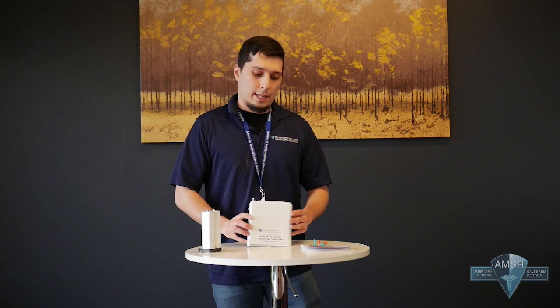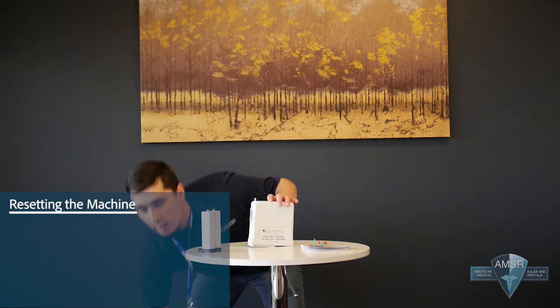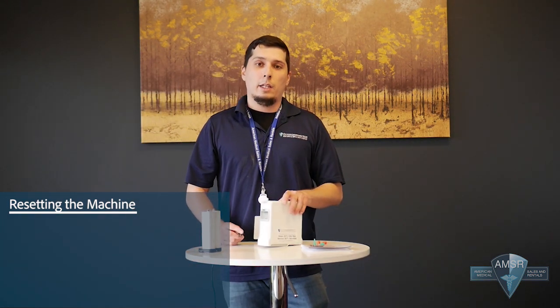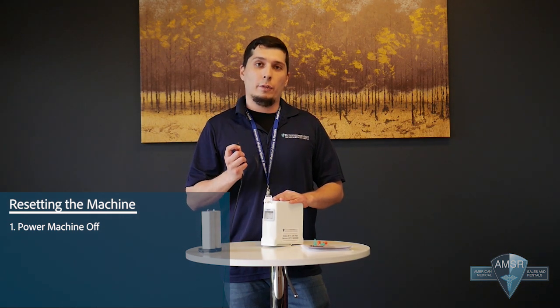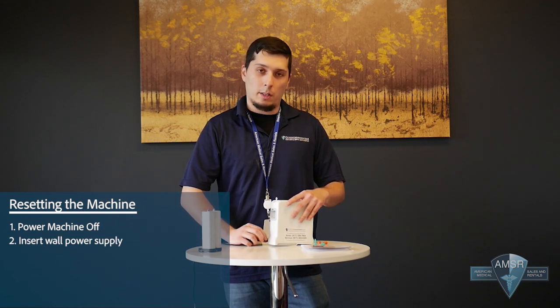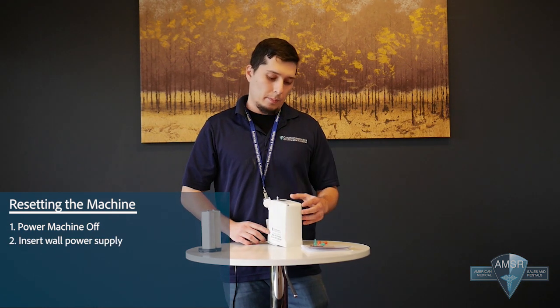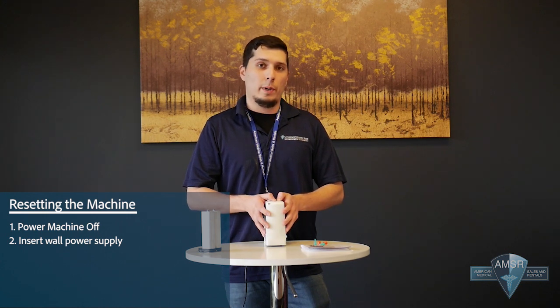So the last step to do within this process is to reset the machine, essentially telling the machine you've inserted new columns. You will get your power supply. You want to have the machine completely off and just have your AC power supply. So while the machine is off, you're going to insert the power supply, and you are going to have to press and hold two buttons. Now mind you, you may need two hands for this.